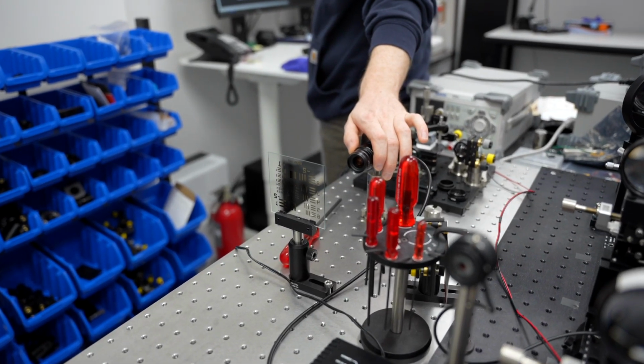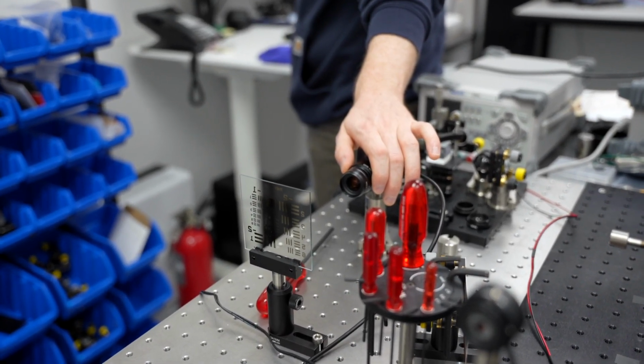color image. But when you don't need a color image, it's actually usually better to use a monochromatic sensor because they have a little bit better sensitivity since there's no light lost to the color filter. And also, since they don't need to go through the debayering process, that actually gives them a little bit better effective resolution for a given number of pixels on the sensor.